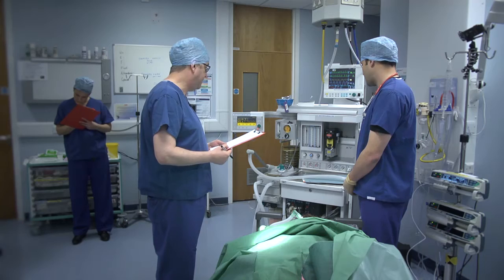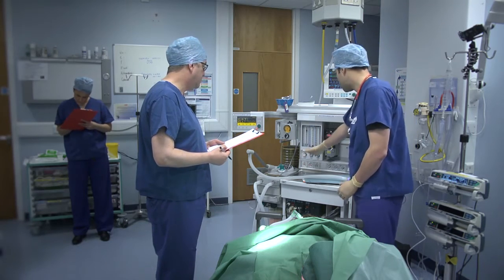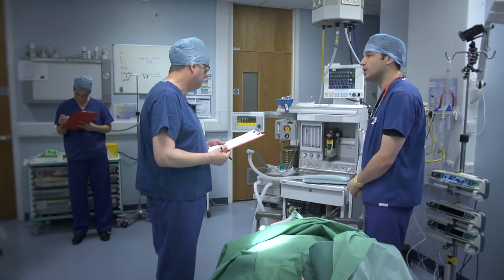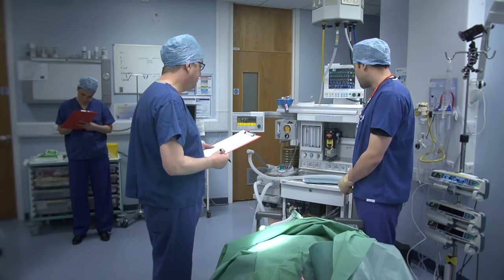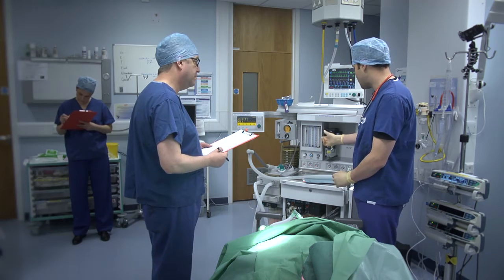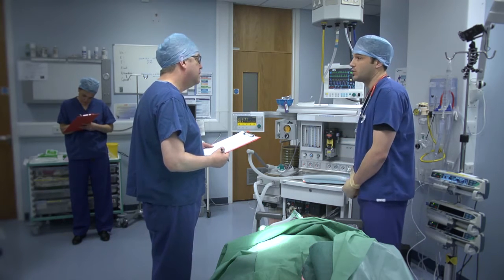Then you adjusted the oxygen — did you have any difficulties when you were adjusting the oxygen? No, I found it quite clear. The label says oxygen, so it was quite clear to see which was the right dial. Could it be improved in any way? The difficulty I had was perhaps in knowing which way to increase the saturation again. Do you mean which way to turn the dial? Exactly that.